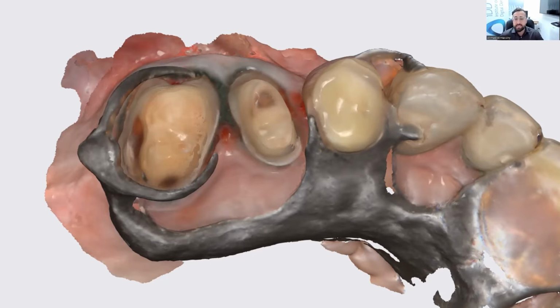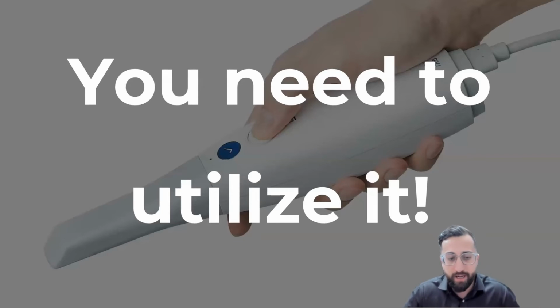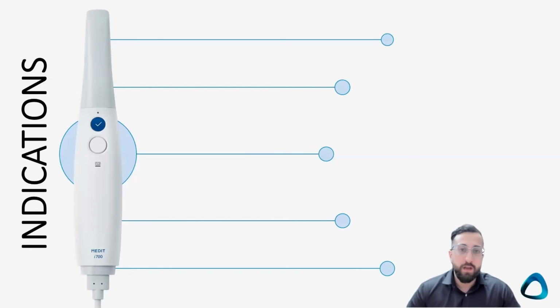A lot of people think scanners can't scan metal, but here's an example. I scanned this partial denture, cobalt chrome. It comes back down to training. How do you scan, the techniques? And trust me, guys, I didn't use anything fancy here, no scan sprays, no nothing, it's just technique and practice. So number one, and it may be a no-brainer for a lot of you, is that you really need to utilize it. You need to use the scanner. Force yourself. I personally use my scanner every single day in my practice. Hours and hours of scanning. And some of you may not even quite fully grasp what you can use a scanner for.